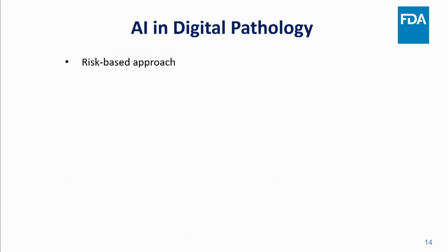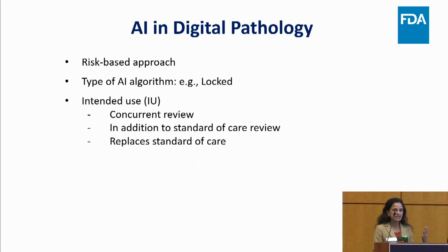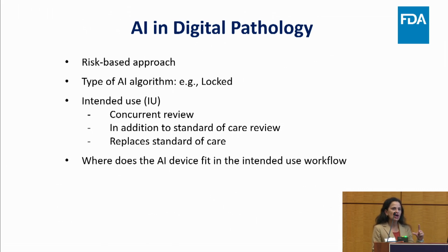And so AI in digital pathology, since we are talking about radiology and digital pathology, I thought this is something that you may be interested in. We have not cleared anything, except there is one in prostate cancer, just last year, that was the very first one that we did. But it's probably not in the diagnosis part, it's adding information. So it depends on the intended use.